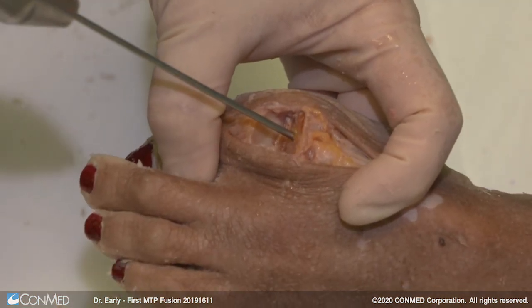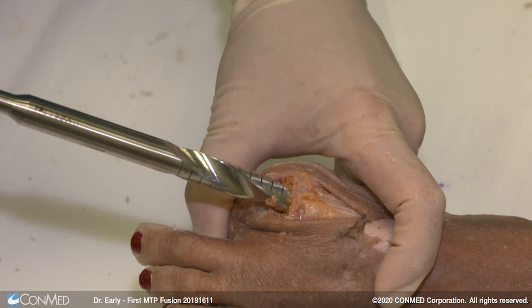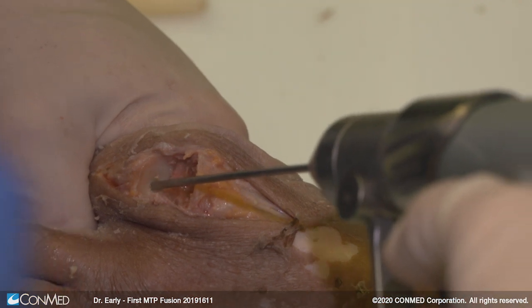You're going to want to put a guide wire down to get into the first metatarsal. It's also going to give you all that great morselized bone graft. The idea is using that dowel to go through here, and then you're going to do the same thing on the proximal phalanx.